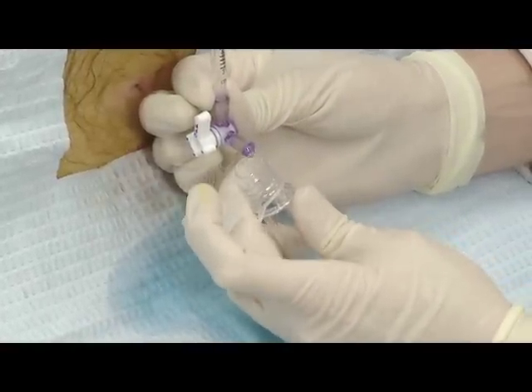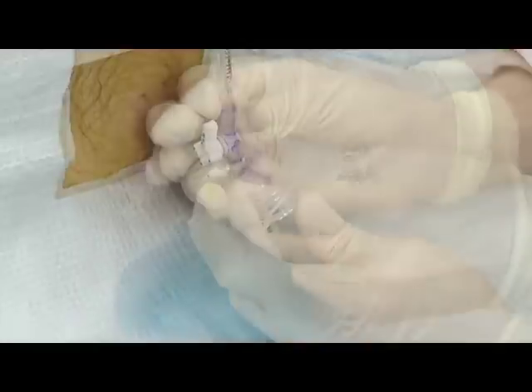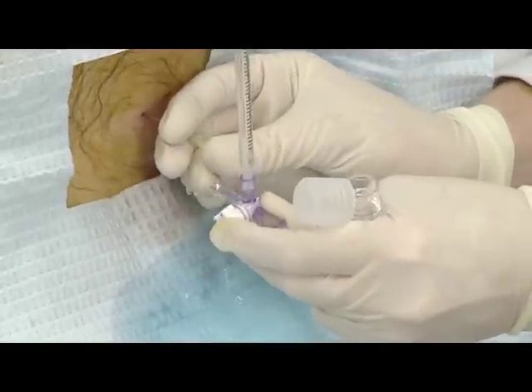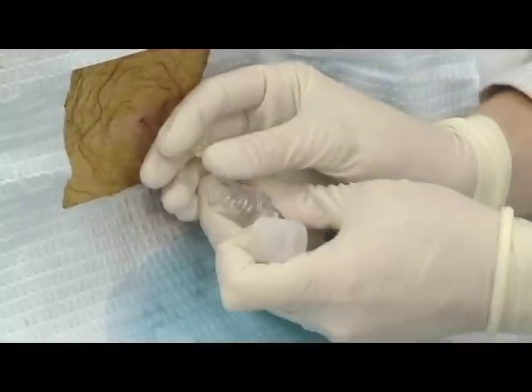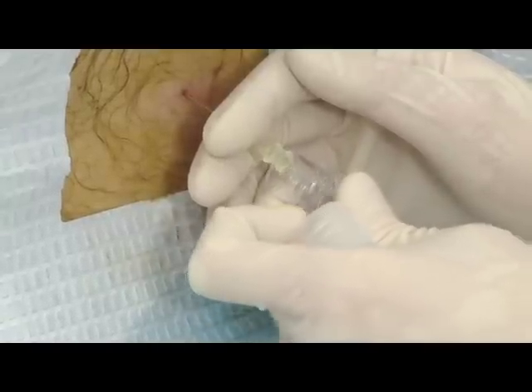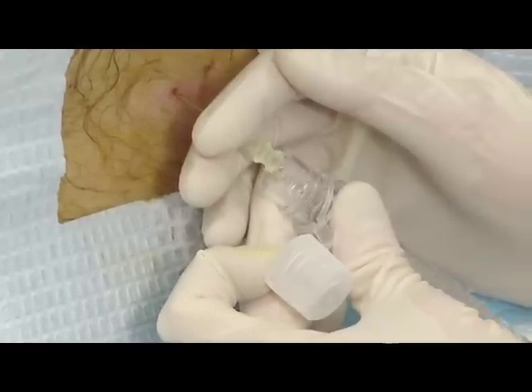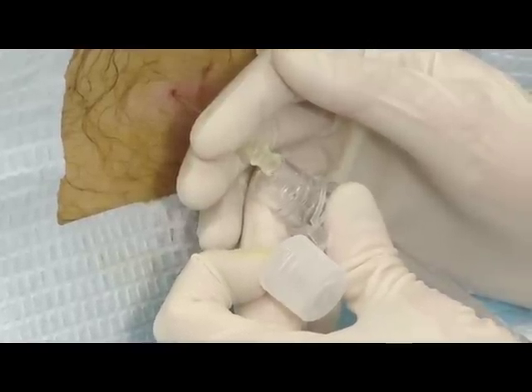Hold the first collection tube beneath the manometer to catch the CSF that will be initially expelled from the device. Detach and set aside the manometer and allow the fluid to drip directly into each tube. Collect fluid in each of the four tubes, at least three to four cc's in each tube, unless cytology is indicated, in which case at least five cc's is required for best results.